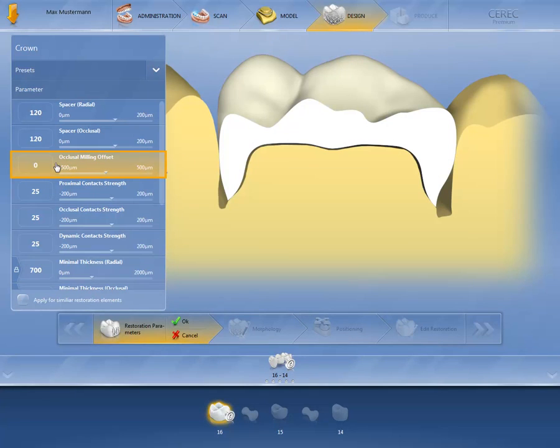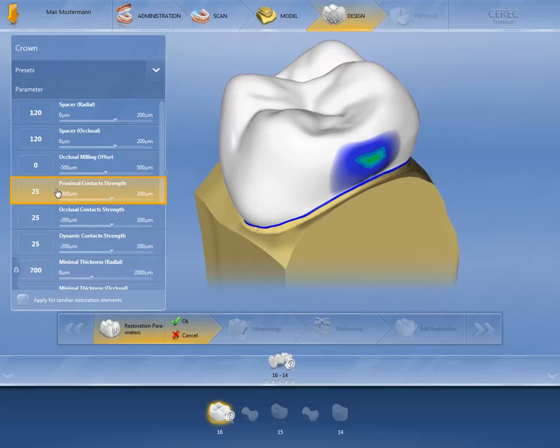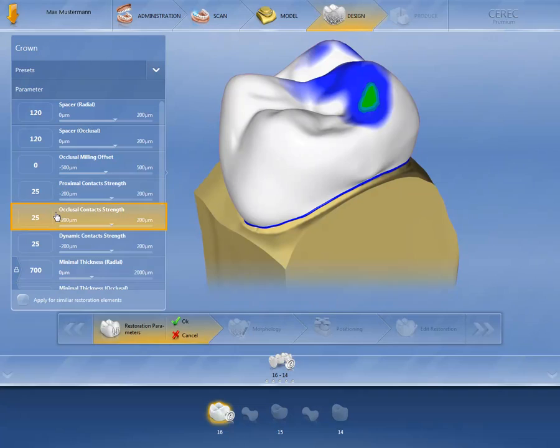With the occlusal milling offset, you can raise or lower material over the entire occlusal surface. Reduce the value if your restorations often need occlusal adjustment. The proximal contact strength determines the strength in mesial or distal direction. The occlusal contact strength determines the strength in occlusal direction. The preset values can be entered directly in the field or adjusted by using the slider.